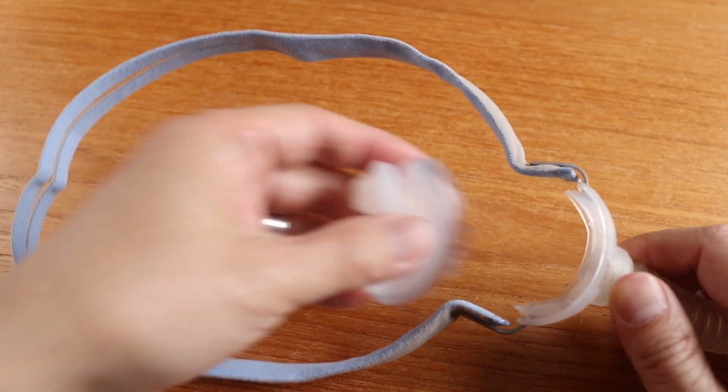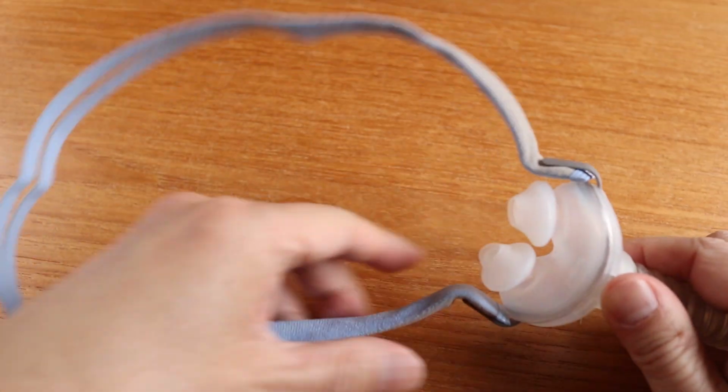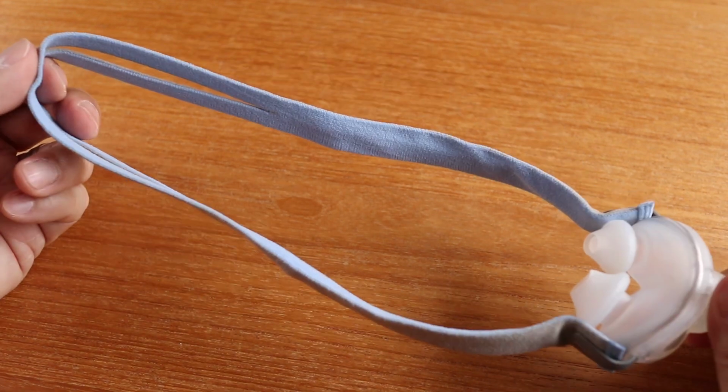Last step is to clip in the air pillow and it's all done. I hope you can see that anyone can do this even if you never tried it before.